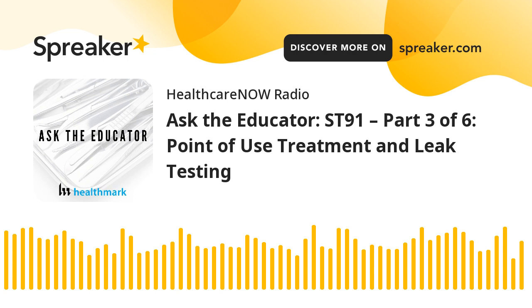Similar to monitoring with PMs and the functioning of any equipment, we're asking now in ST91 that leak testers deserve that same level of quality control, so that we need to make sure the PSI is correct, not just that it makes a sound and you can tell that it's on because you hear a motor running or you press a pin and hear a whoosh sound. We need to know that it's delivering the correct PSI. If it doesn't deliver the correct PSI, you could be missing some of the leaks, and every leak is significant.